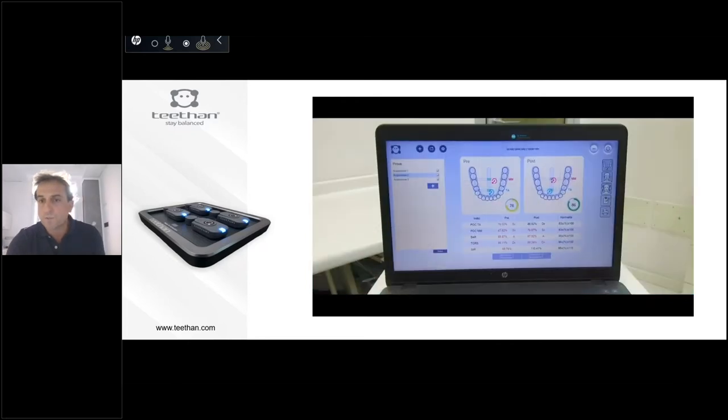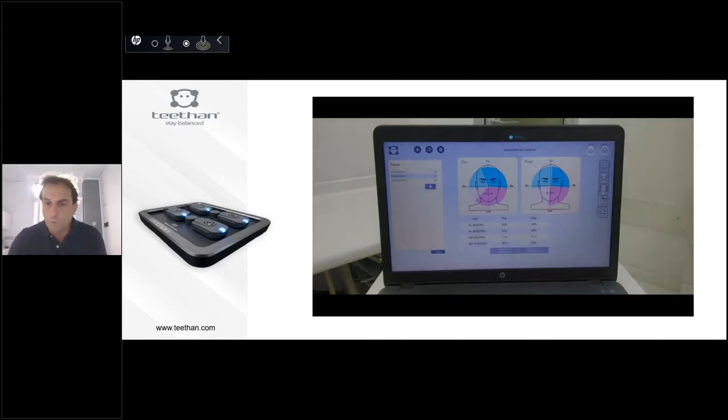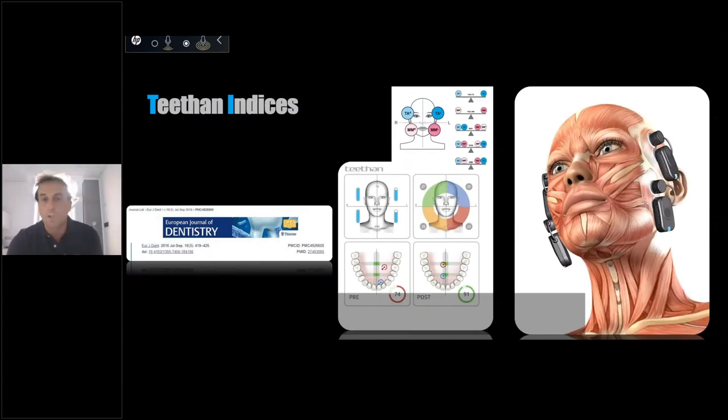As you can see on the screen, it's simple to understand the use of this instrument. You have some measures, and you can control these measures at the beginning of the therapy, at the end of the therapy, and during the therapy. And I think it can help you to understand the patient better. You have some indices for Teethan, and you have, for example, the value of the temporal muscles, the value of the masseter muscles, and the position of the mandible in space.